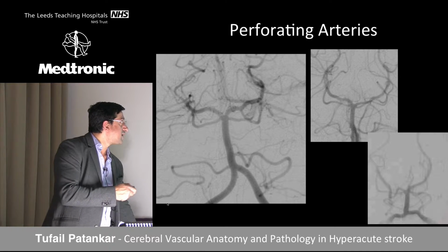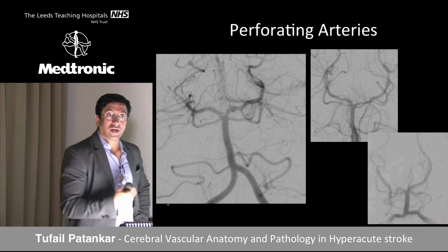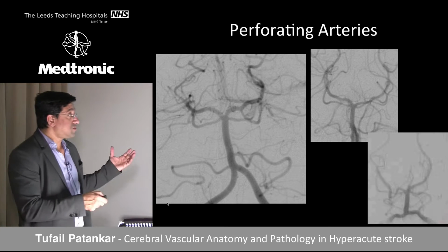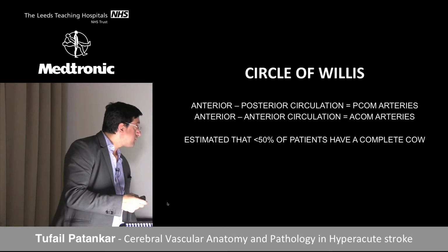Basilar artery, again, there are perforators. And it's very important when I do thrombectomies, I need to look at these, okay? When there's a clot, I don't see them. When I open the arteries, I want to see these coming out, okay? So that's very useful when I start seeing them. When you see clots here, you don't see anything.